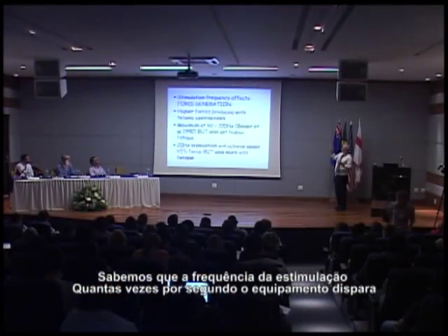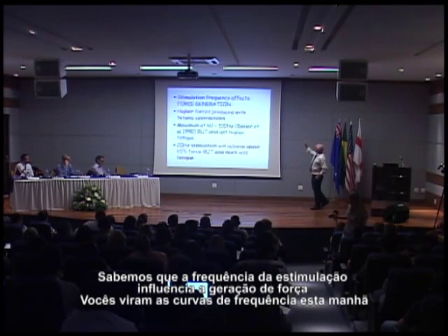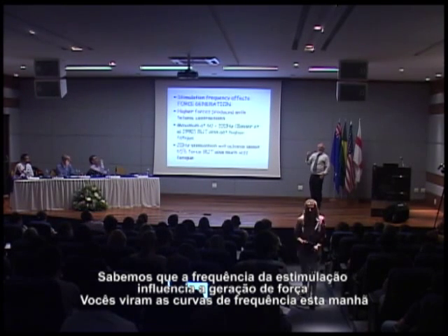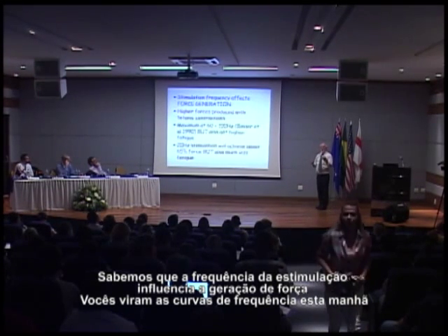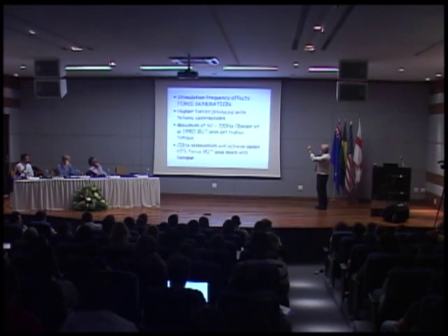We know that the stimulation frequency, how many times a second the machine fires, influences force generation. You saw the frequency curves this morning.